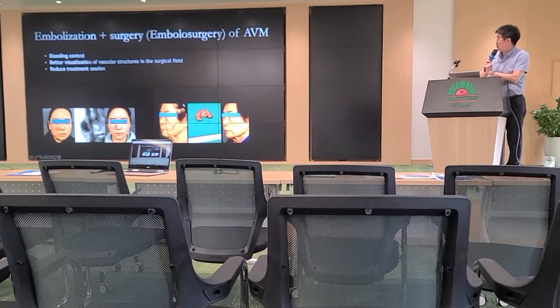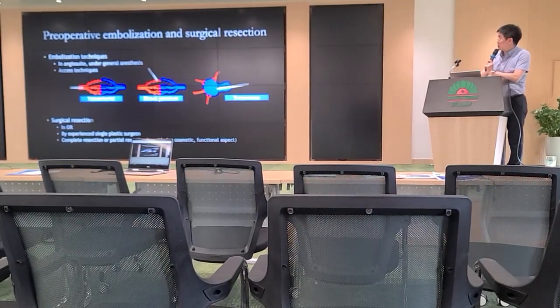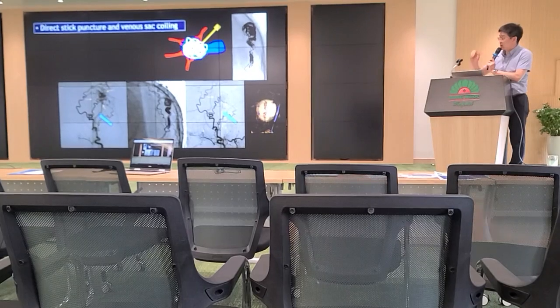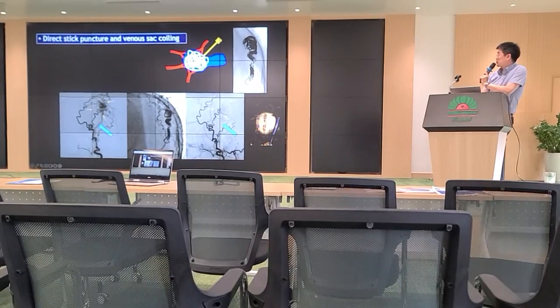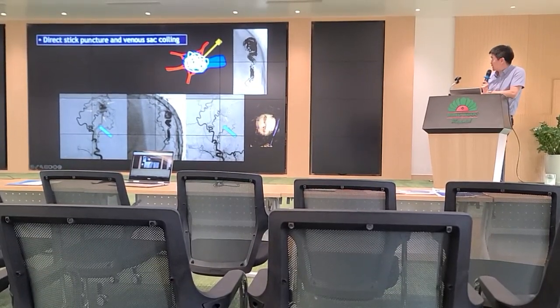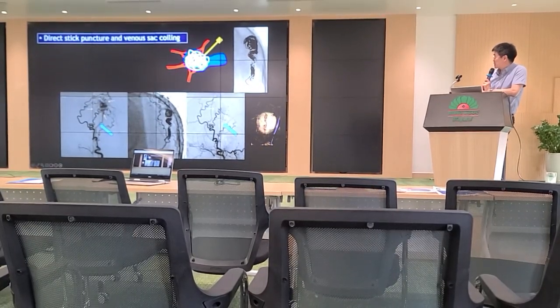And this similar case, we use various angiographic access techniques. This is the scalp AVM. I put some direct puncture and coil embolization. The AVM was gone, and on the same day, the lesion was resected.